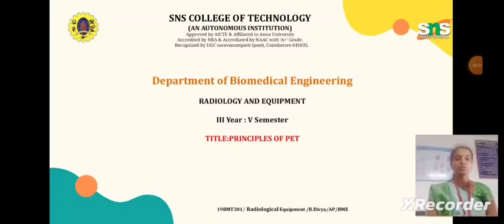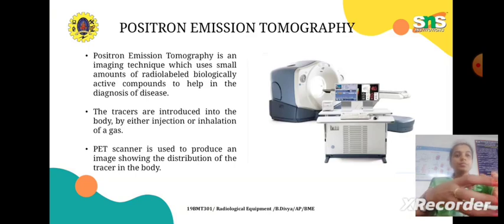In this video, we are going to see the principles of PET. What is PET? Positron emission tomography. It is an advanced CT machine. As I already told you, positron emission tomography, PET.